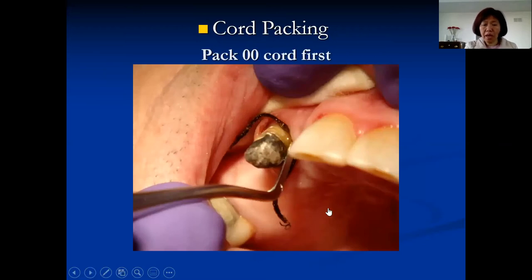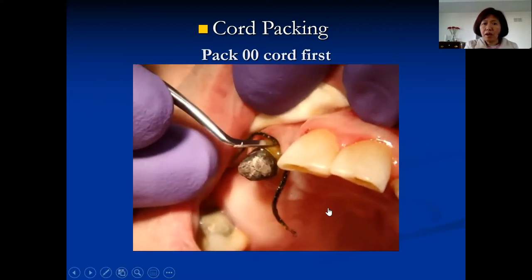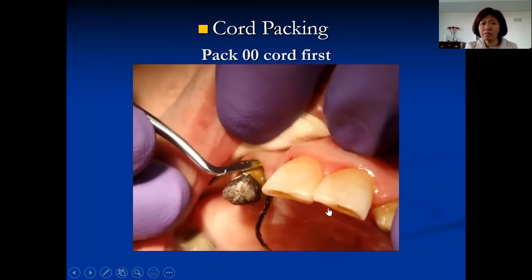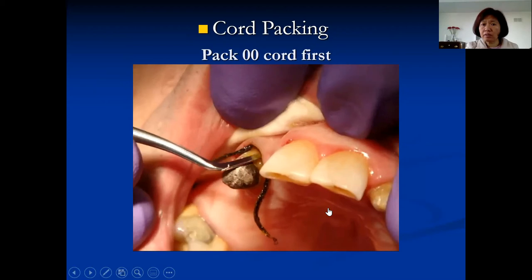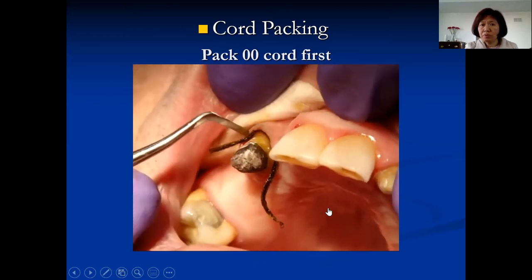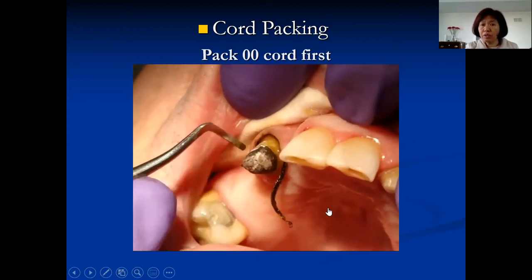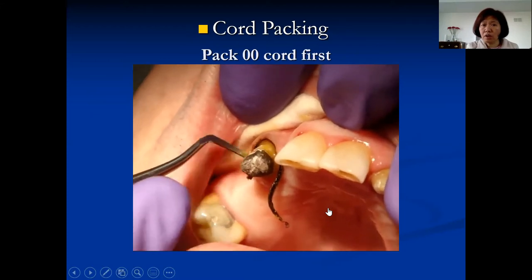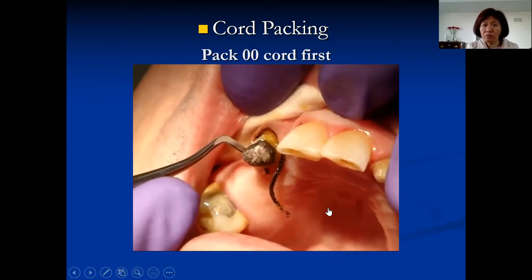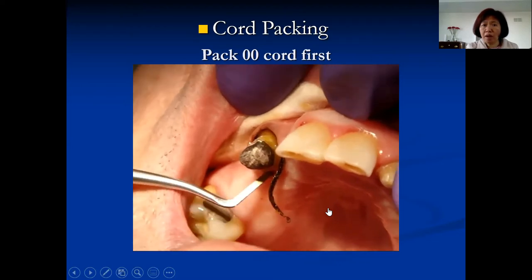This is a video of how to pack cord. A very common complaint from students is: I push it and it bounces back. You have to use a certain rolling motion — look at the movement. The tip of the cord packer needs to roll slightly to push the cord down and let it settle under the gingiva. You have to feel where the margin is, where the gingiva is, and where the sulcus is. Press the cord past the margin into the sulcus, then roll a little to let it sit under the margin. If you just push straight down, it will come right back up.